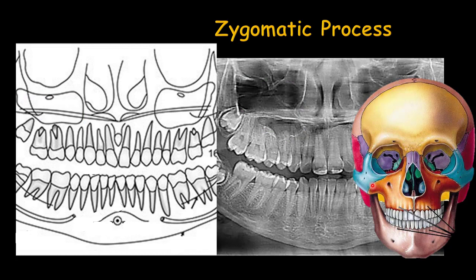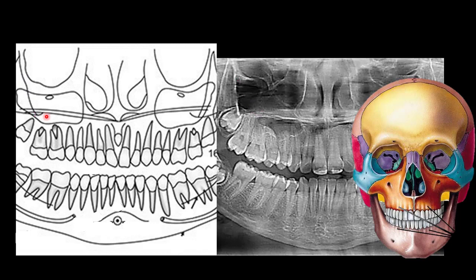The zygomatic process of the maxillary bone sutures with the zygomatic bone and is superimposed on the maxillary sinus as a U-shaped cortical bone, which you can sometimes detect in a panoramic radiograph. The orbital wall is at the top of the maxillary sinus, and the inferior wall of the orbit is intact with the superior wall of the maxillary sinus. It's very important to detect that cortical bone and confirm it is intact, because in fractures this inferior orbital wall can be fractured and some parts of it can go inside the maxillary sinus.